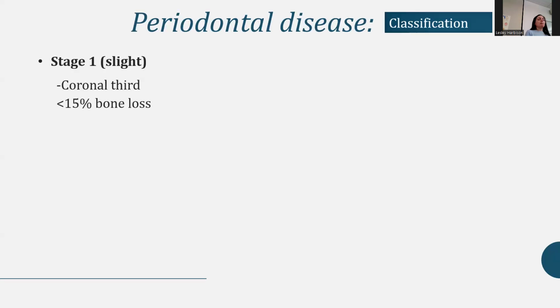They're basically saying mild, stage 1, moderate, stage 2, severe, 3 and 4. And then I've heard advanced perio, which might also mean tons of mobility, not responding well to treatment and things like that.